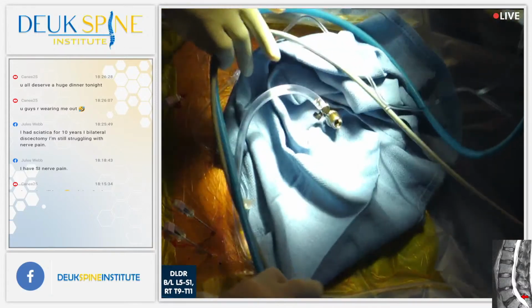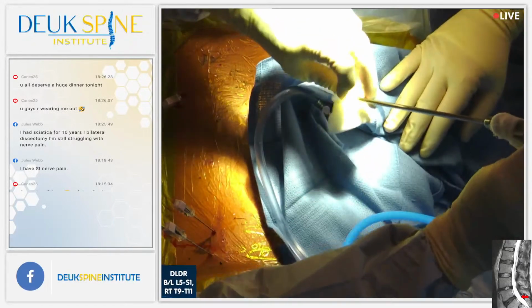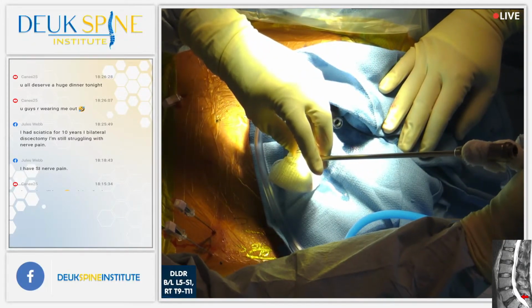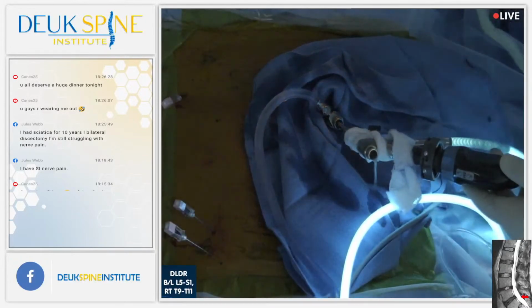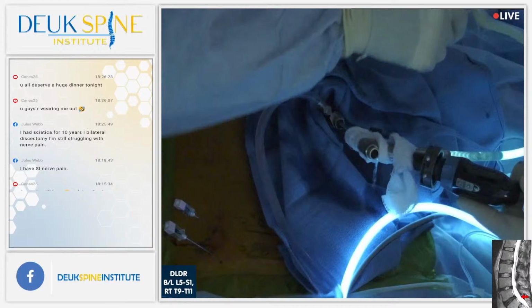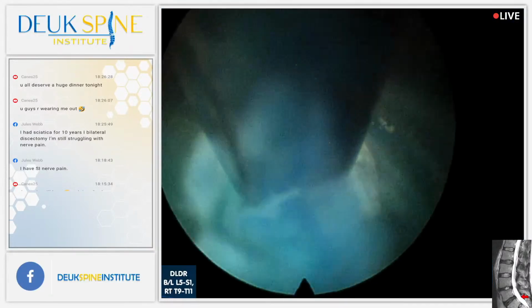Yes, please. I will tell you, one second. We had to white balance our camera. All right, there it is. There's the tear. And you can see the blue herniation. So already we're hitting the jackpot.